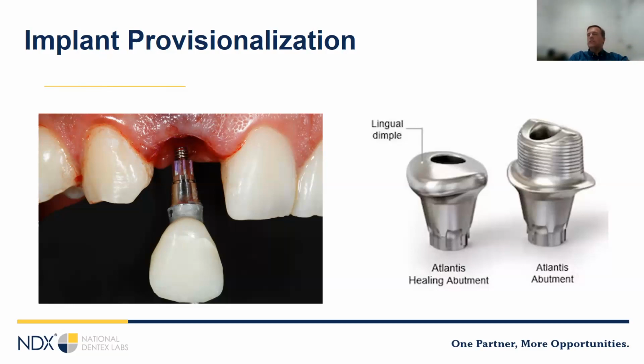There's usually a way to generate a printed model that shows the proposed analog position based on a surgical guide. And sometimes you can even get a digital model, so to speak. That way you're doing the whole thing in digital space. So in your model, then of course, the tissue is going to be or can be reflected. So we want to shape an ideal emergence profile, and then we want to create whatever we're making to that profile. We can make a custom immediate temporary crown, which can be really nice.